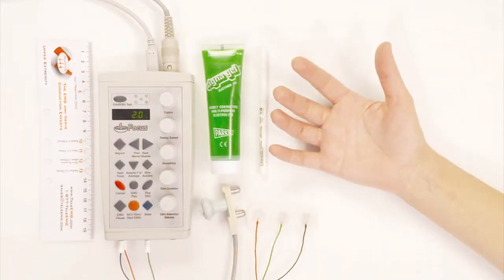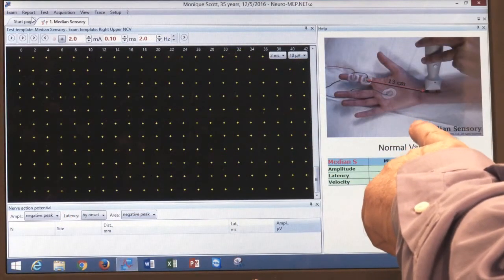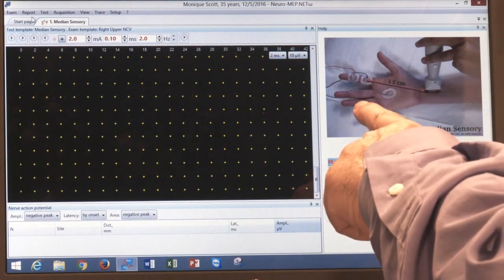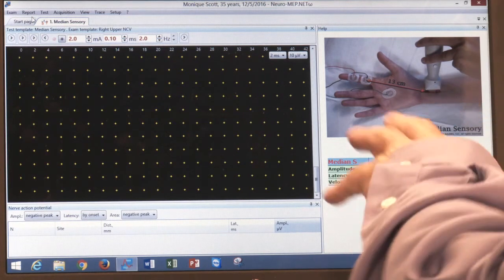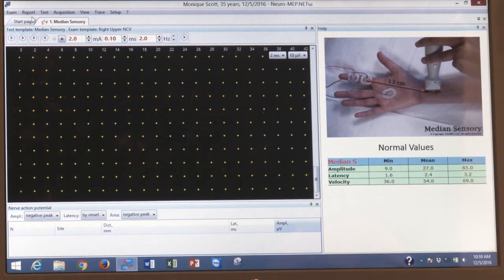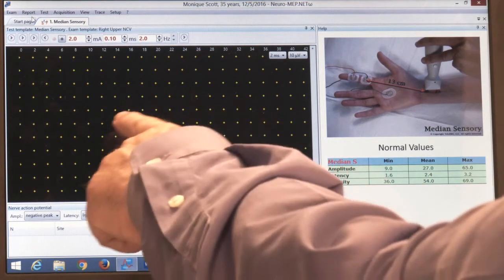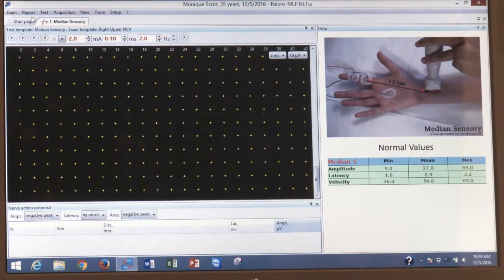So let's get started. The first nerve we're going to study is the median sensory, and you see here a picture of the setup of the median nerve. It shows you where we place the electrodes and it shows you where we actually stimulate the nerve at the wrist here. Below that, you see also some expected normal values that we would compare the potential that we get from the patient and compare it to the normal values that we have on the screen here.